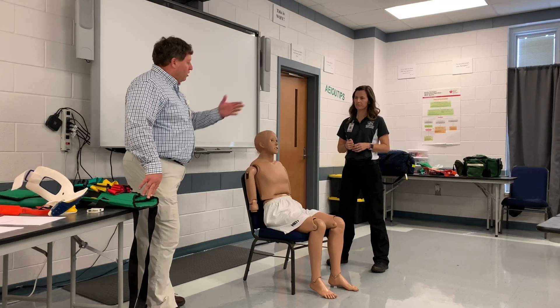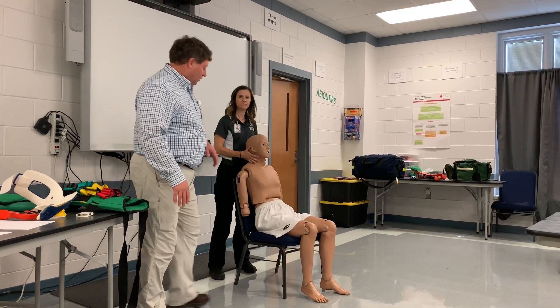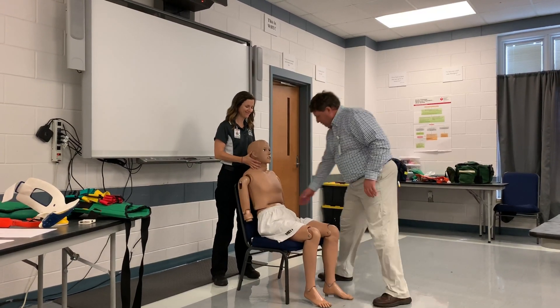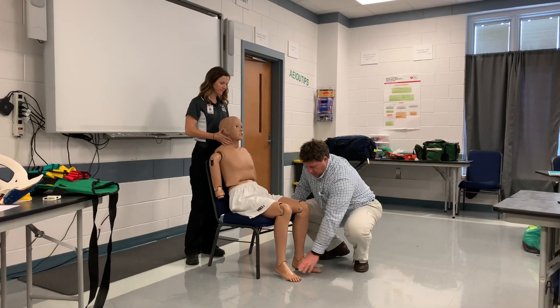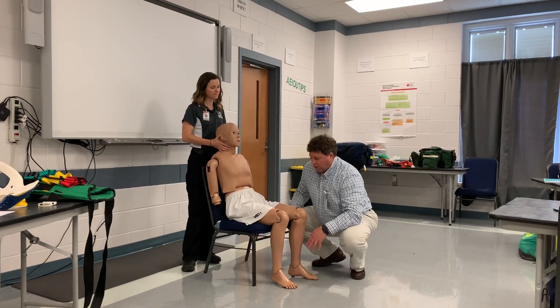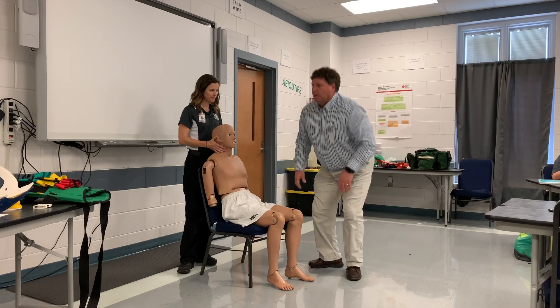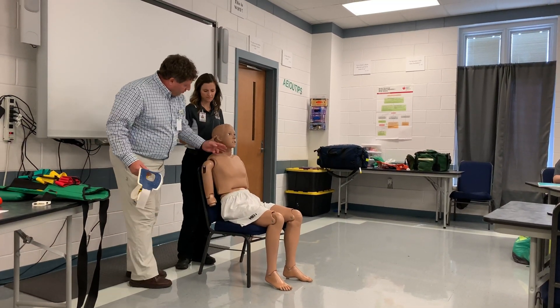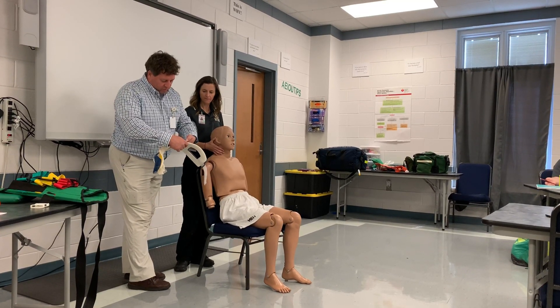Then I could have to use one of these. At this point I assess my circulation, sensory motor - same thing here. Patient has some neck and back pain, so I can't rule out I'm going to have to use my KED. I'm going to measure my C-collar. Remember, we use the angle of the jaw, top of the shoulder - however many fingers that is. Use your sizing posts on the side.